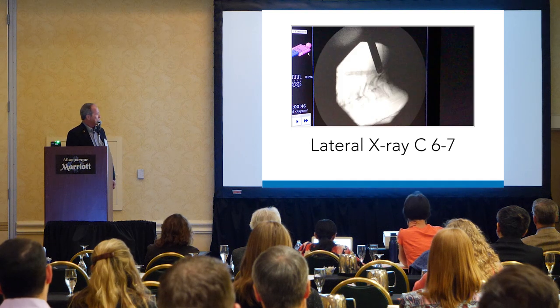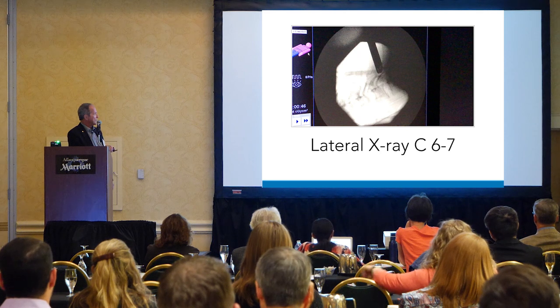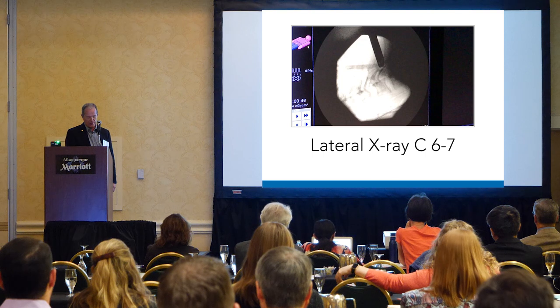This is just an intraoperative X-ray to get a sense of where we are. If you wonder, there's the descending facet we're going to be on top of. There's the disc space with the disc herniation.